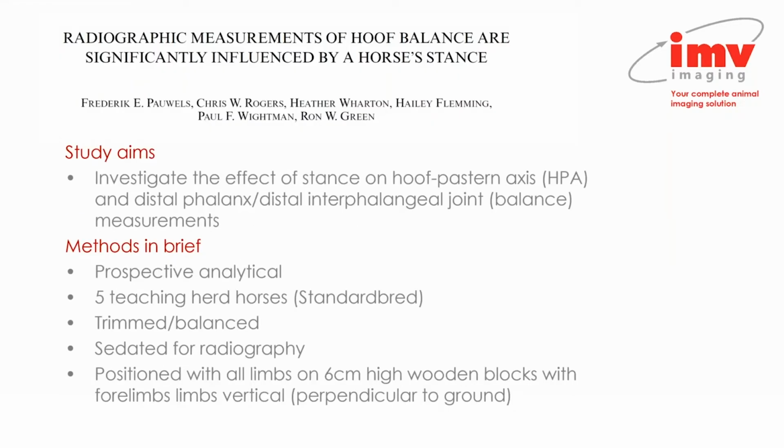So our next study is radiographic measurements of hoof balance are significantly influenced by a horse's stance. So this is again a very similar paper in a way, looking at the effect of horse stance. So in this study, the authors wanted to investigate the effect of stance on hoof pastern axis and distal phalanx and distal interphalangeal joint balance measurements. This was another prospective study. They had 5 standardbred horses that they used.